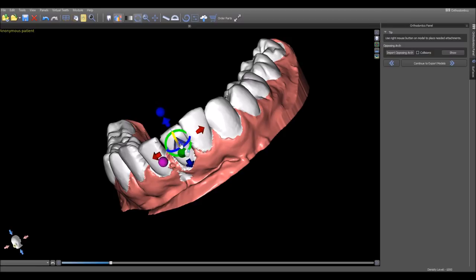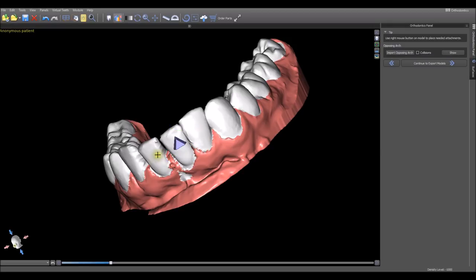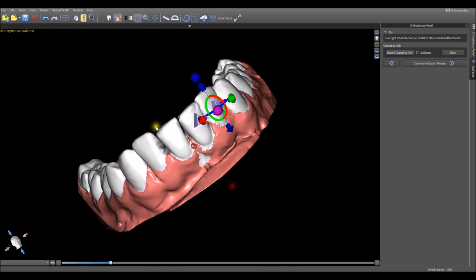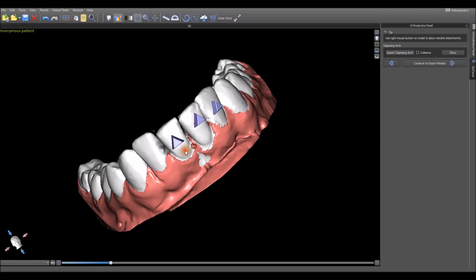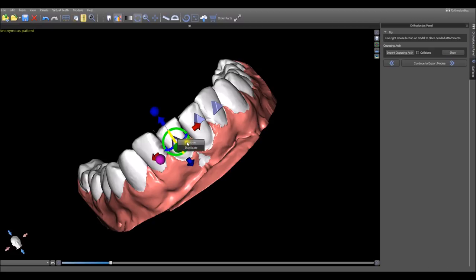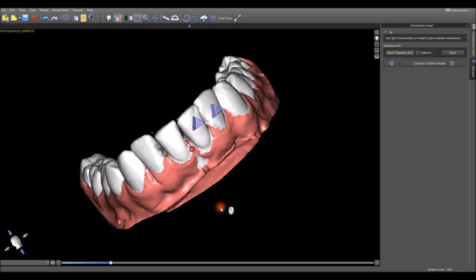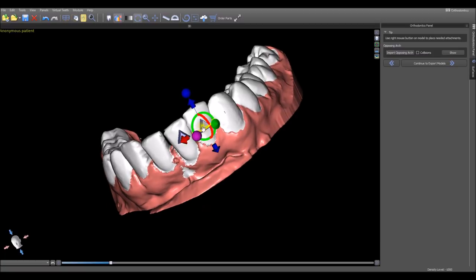If we want to place another button, we can press the duplicate button and then click on the next relevant tooth, or we can click on a tooth and click add button to add a new button or add previous button to add the same shape and size to the relevant tooth. Removing a button is just right clicking on the button and clicking remove.